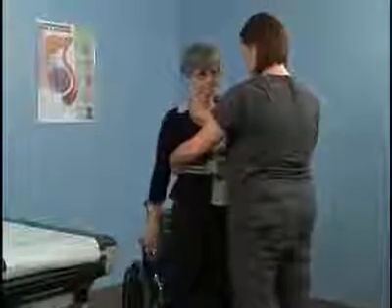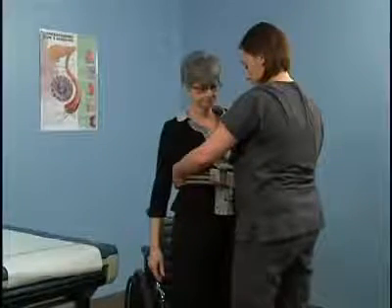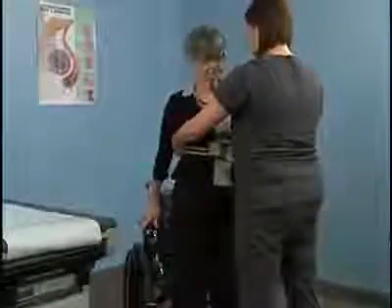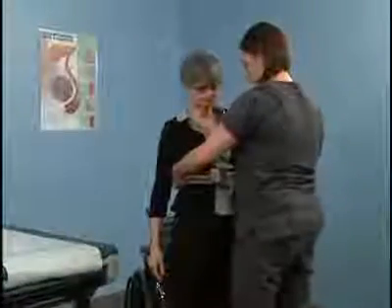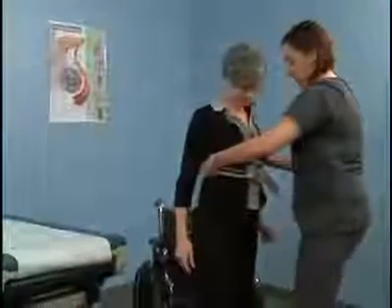Straighten your knees and assist the patient to a standing position by pulling upward on the transfer belt. Make sure to keep your back straight and lift with your knees, arms, and legs, and not your back. Pivot and position the patient's buttocks and back of the legs towards the examining table. Instruct the patient to step backwards onto the footrest 1 foot at a time.